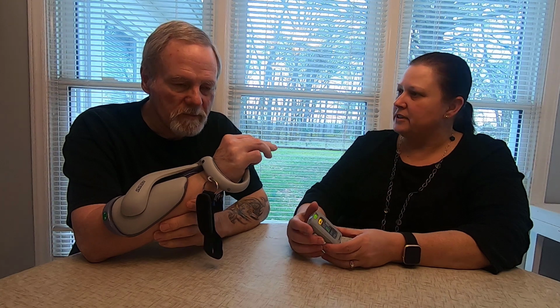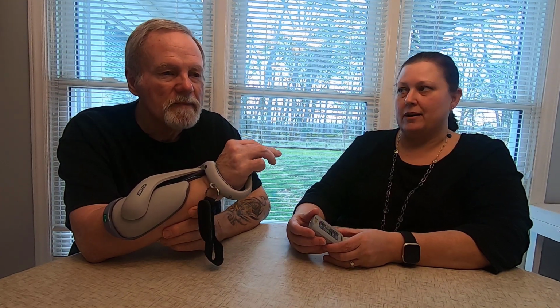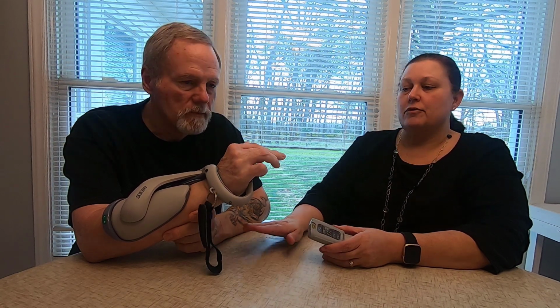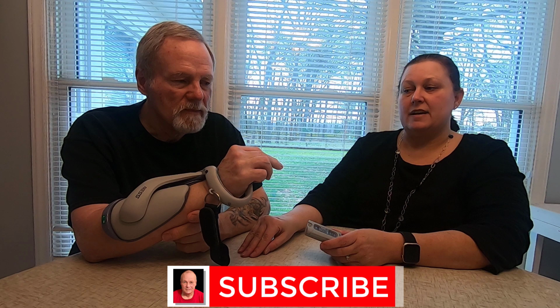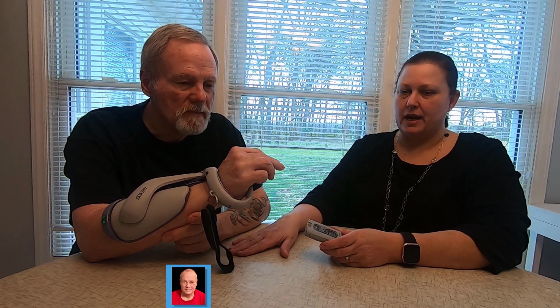And it has a couple of different cycles that it goes through that do different things. So we're working back up now to him being able to use it an hour and a half, 2 different times a day. So right now he's only using it an hour once a day. And our goal is to get him back to using it 3 hours a day. So an hour and a half in the morning and an hour and a half in the evening.